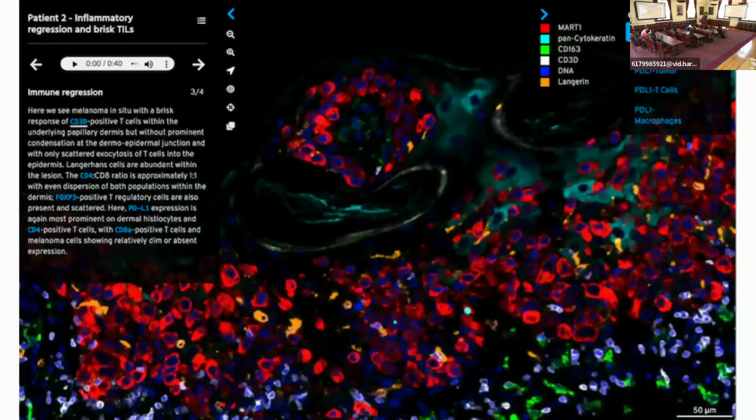This is a great adjunct to your paper where you want to share, again, not just that tiny little postage stamp. You can share this link in your supplementary material and have your viewers actually navigate through images.